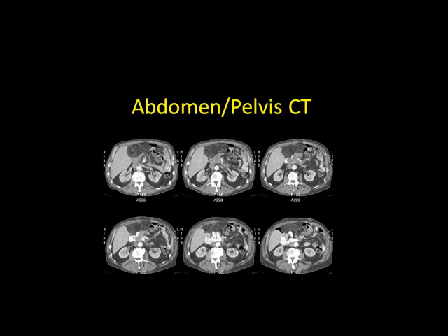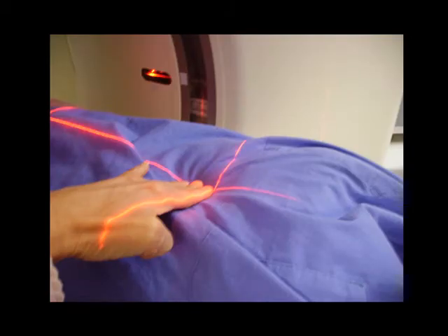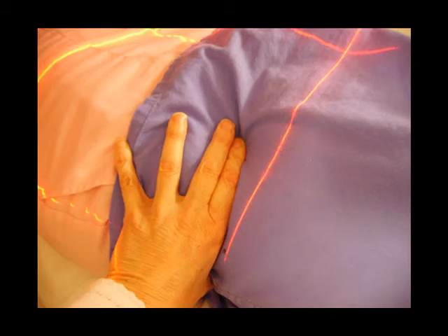We already saw a video that included that in it, but just to refresh your memory, if you're setting up for an abdomen and pelvis that you're doing together, or you're just doing the abdomen, you're going to mark at the xiphoid tip. Okay, abdomen and pelvis, or just plain abdomen. Your starting point, your marking point, that axial line goes at the xiphoid tip. Now, if you're just doing a pelvis, and sometimes you do just do the pelvis, you're going to mark it at the crest.